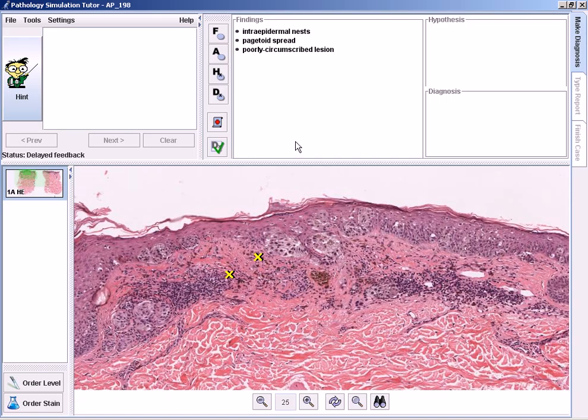and anything that's selected will appear on your screen. Now there are also different options that you have to select from when you right click on a finding that's listed up here.